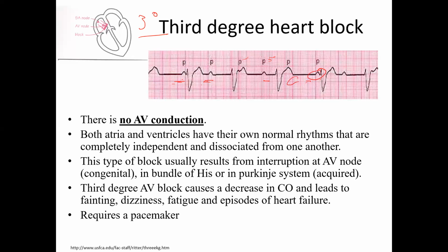So for our class, I think the first thing you should notice is the wide QRSs. These are not normal. And then you see the erratic. There are P waves. That's what I told you from the first day on how to look at these EKGs. Always look for the P wave, because this one you have a P wave. So you can't call this ventricular rhythm. This is not ventricular rhythm.